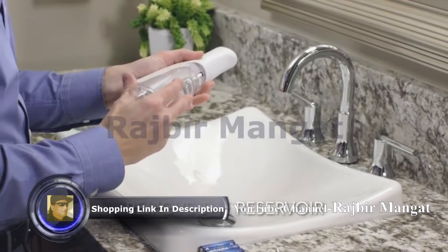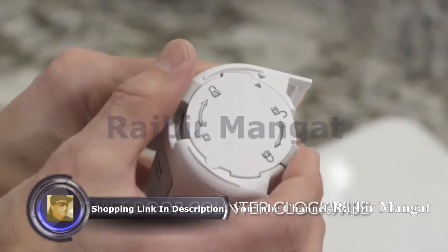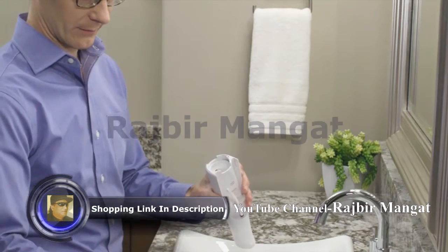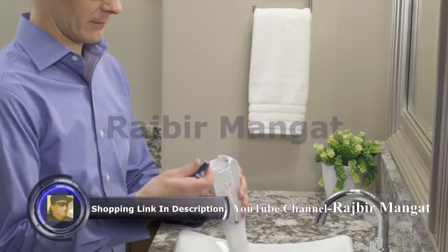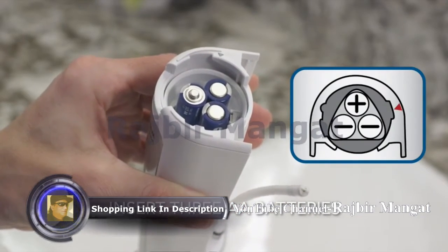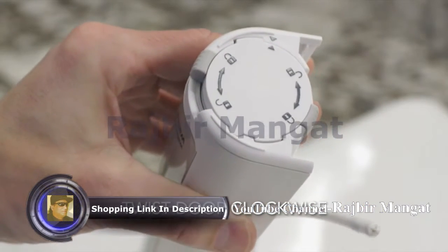To get started, remove the reservoir from the device. Next, remove the battery door by twisting counter-clockwise and pulling. Once the battery door has been removed, insert three AA batteries in the correct direction and replace the door by lining up the arrows, pushing and twisting clockwise.